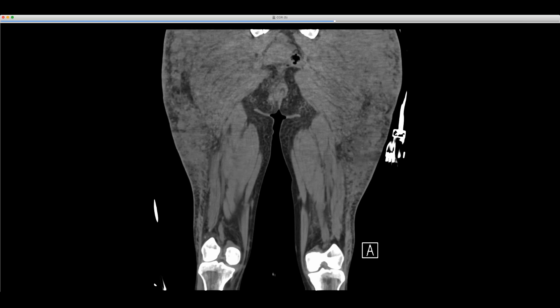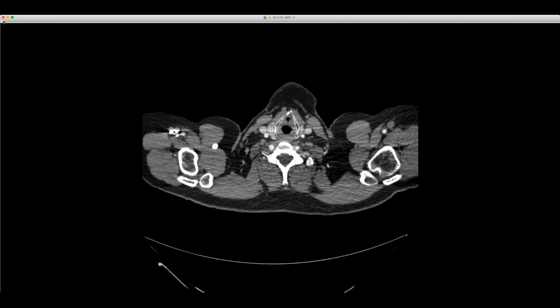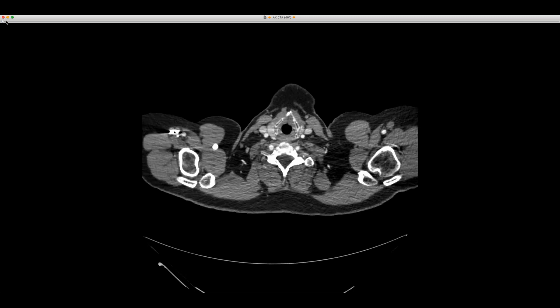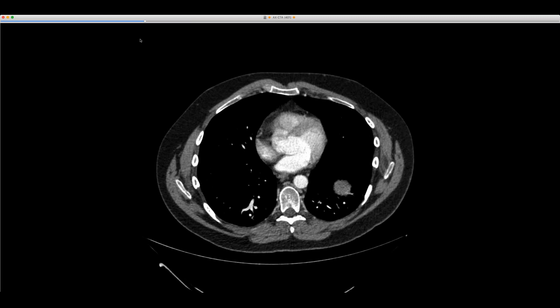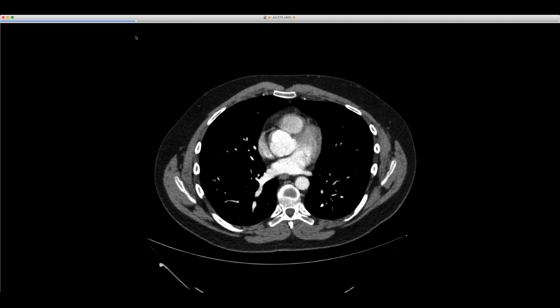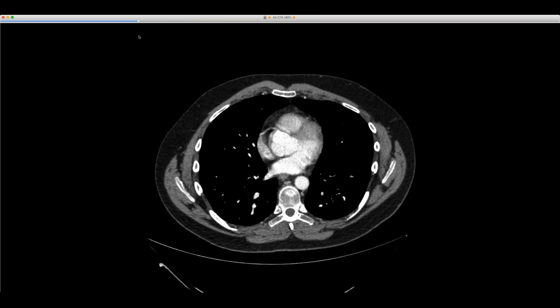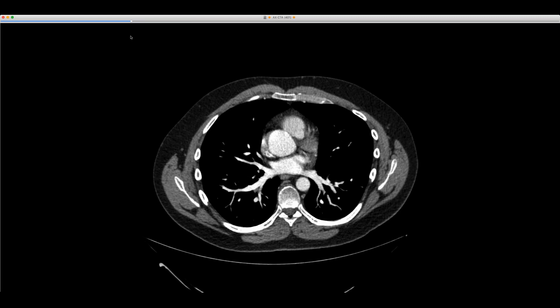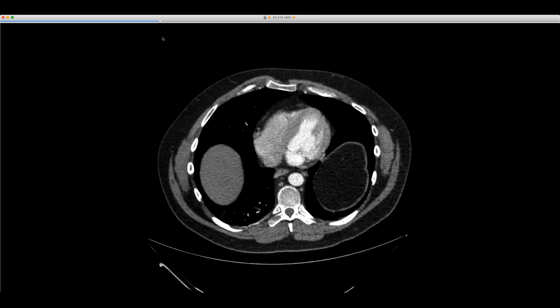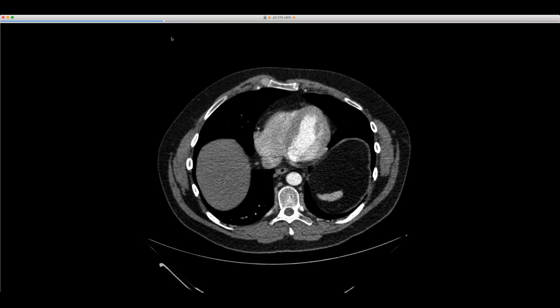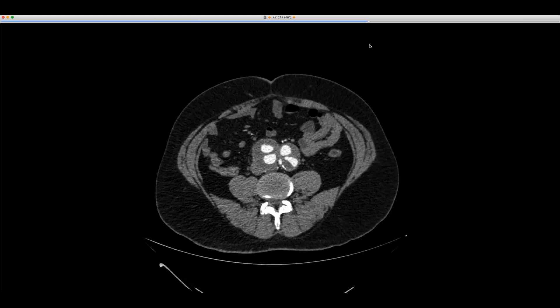Let me show you this case billed as Marfan syndrome. You can see the aortic root measured about 4.0 to 4.1. Going down, the dramatic finding in the abdominal CT was a dissection. However, this is obviously not the typical appearance of a standard dissection due to hypertension — it starts in the infrarenal abdominal aorta, which is always a sign that this is definitely not a typical dissection.